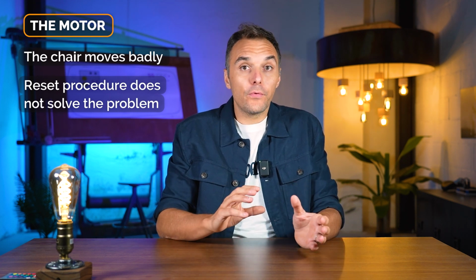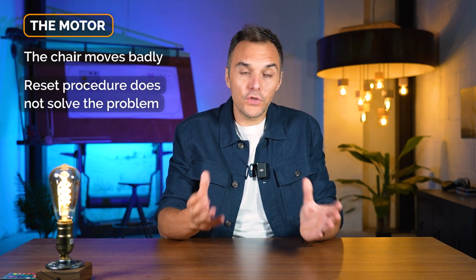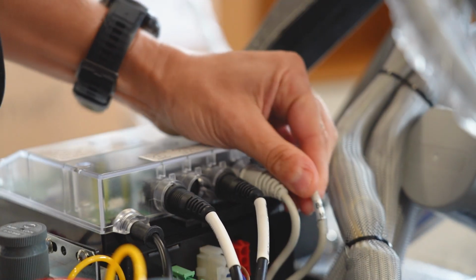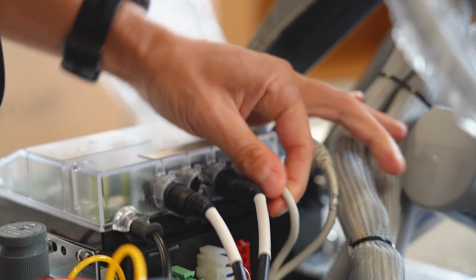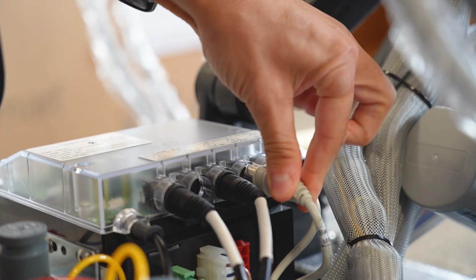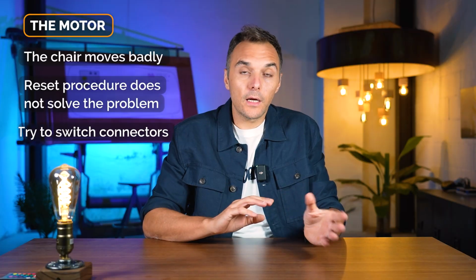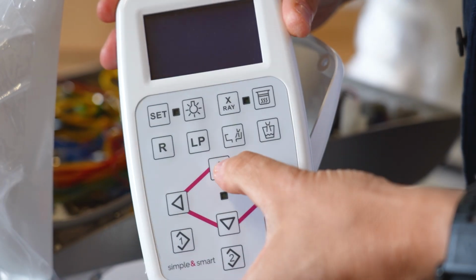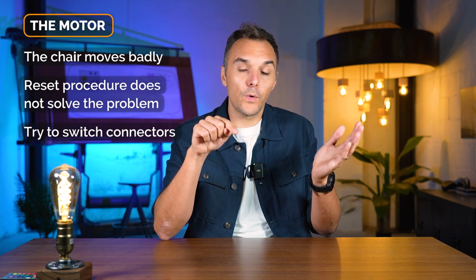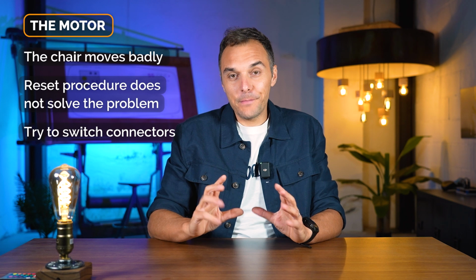To check the motor before removing them from the dental chair, which is quite a complex situation, you can switch at the chair base. We have two connectors, one for the motor of the seat, the other one for the motor of the backrest. If you switch these two cables and insert them the opposite way, so you just invert them, in this way we can check by pressing the control panel of the doctor if the chair backrest is moving back and forward or if the problem remains as before. So I try to be a bit more clear.